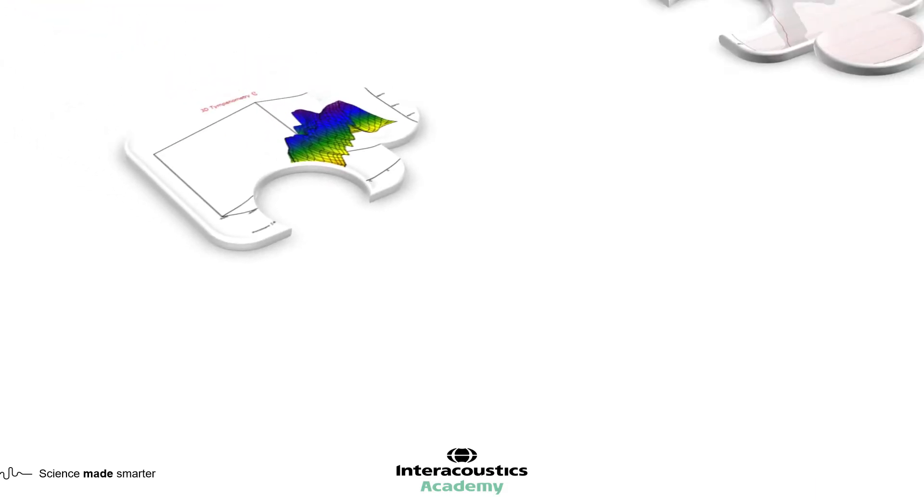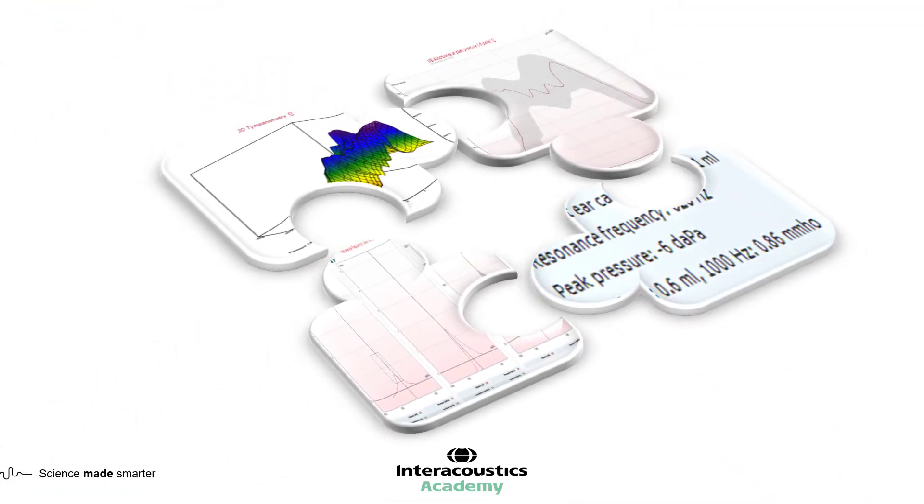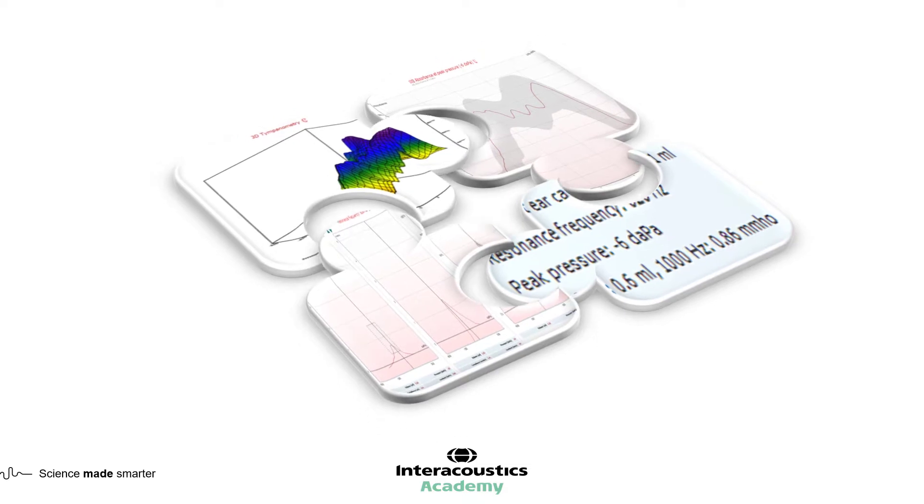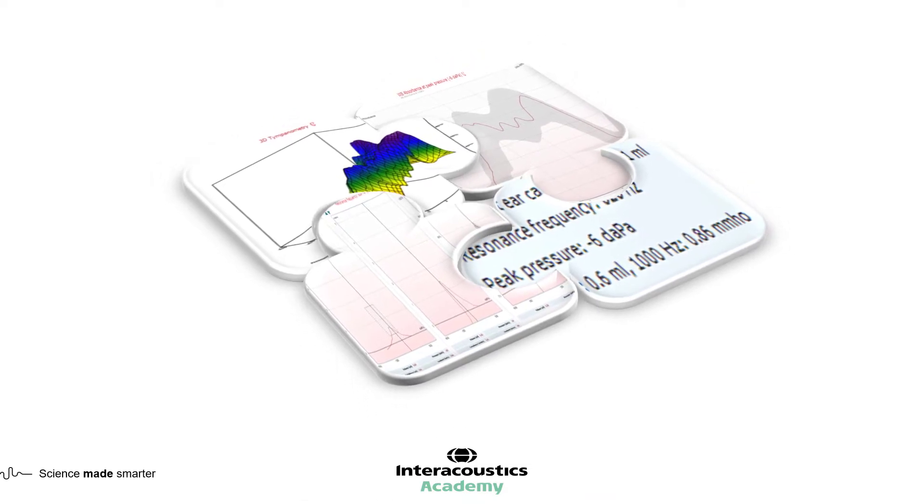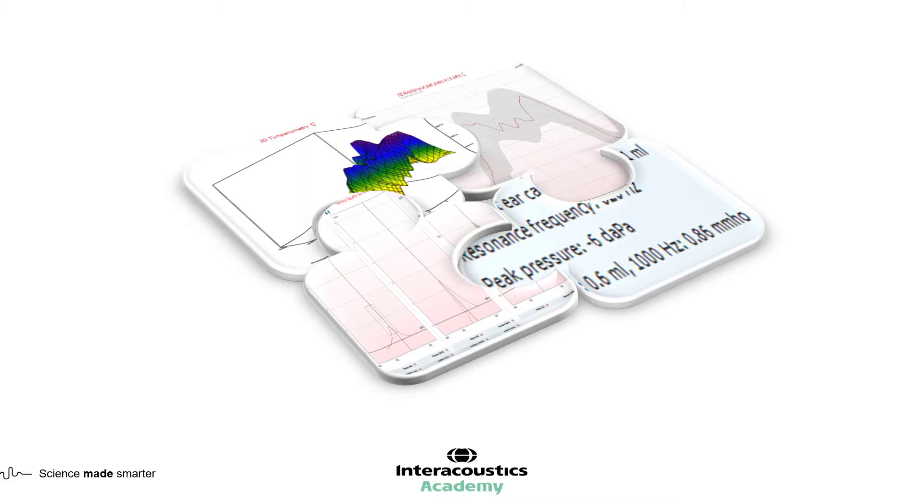Furthermore, within a wideband tympanometry measurement each piece of data must be considered alongside the other results provided. It is not recommended to make interpretations based on single components such as the absorbance graph or the resonance frequency value.